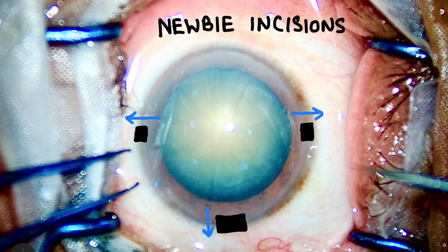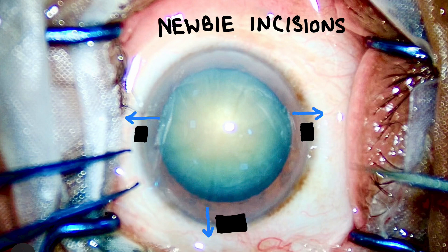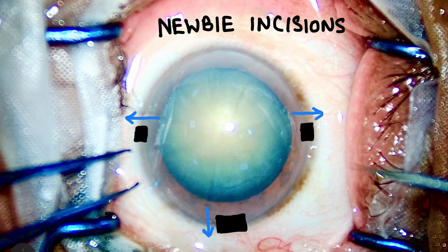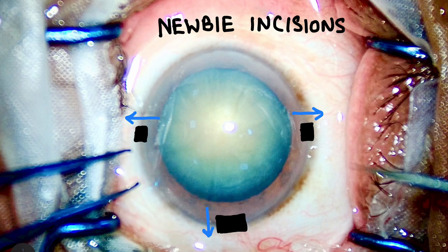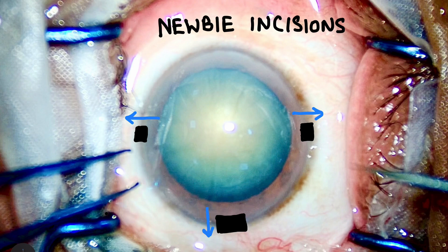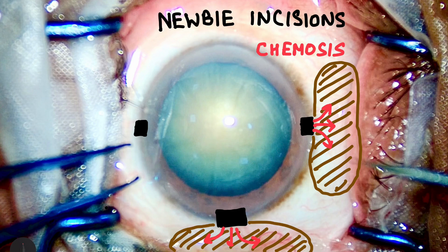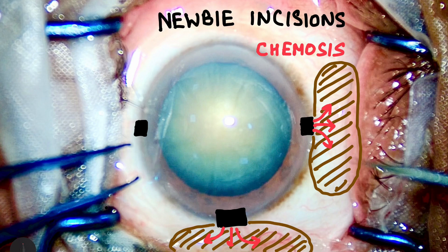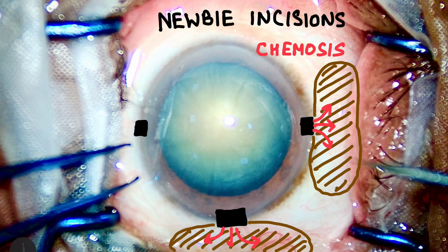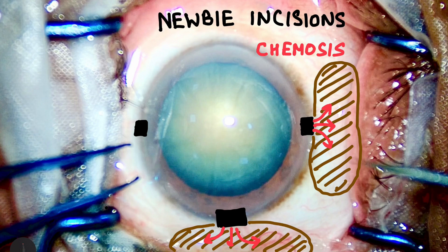The sixth mistake a new surgeon makes is not going toward the junction of the sclera and clear cornea — not making perfect side ports on the limbus but somewhat through the conjunctiva. Once you start putting the phaco and irrigation fluid starts flowing out of the side port and main port, the conjunctiva starts to swell up, leading to a lot of chemosis in the adjacent areas. That causes decreased visibility for the surgeon, pain to the patient, decreased patient cooperativeness, increased positive pressure, and you are inviting complications if you create side ports toward the conjunctiva.